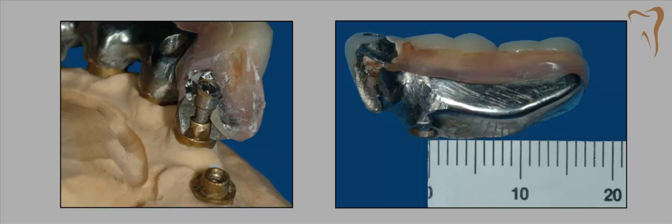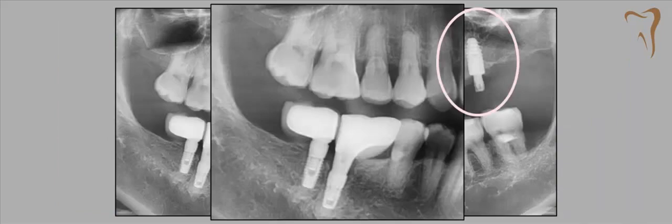Now, when this case came into the office, it was for retrieval of that upper number 15. But what was so interesting to me is the lower right. And I don't become speechless very often, but when I saw this X-ray, this lower right, I said, "Good golly, look at the torsional loading on these two molars, implant position. There's just nothing that is biomechanically correct to give this young man really longevity in this case mechanically."